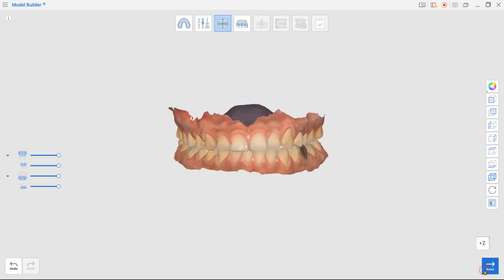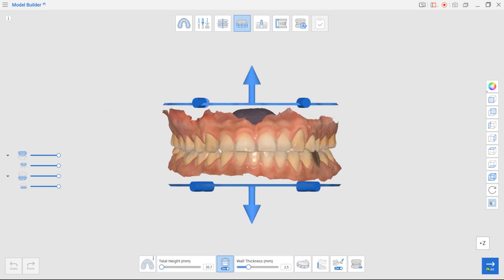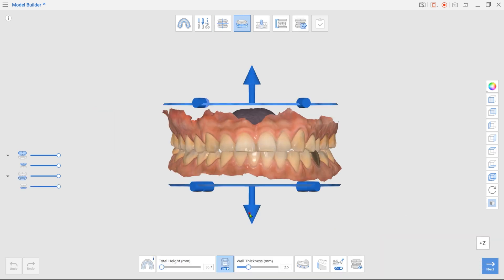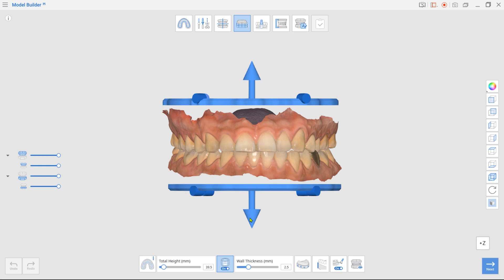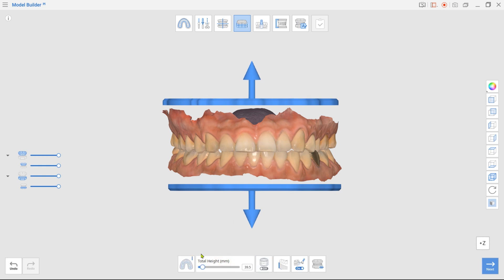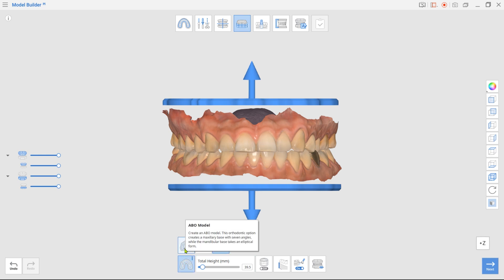Next, we have Base Creation mode. Drag arrows up and down to adjust the base height and turn off the Hollow Shape option. Don't forget to select the ABO Base Type in the toolbox below.